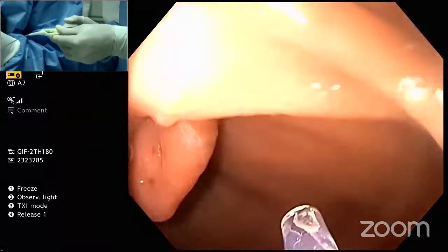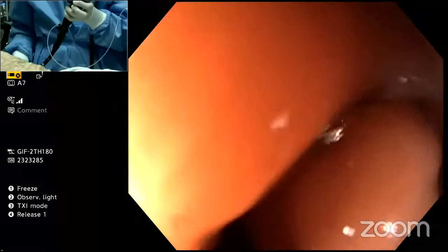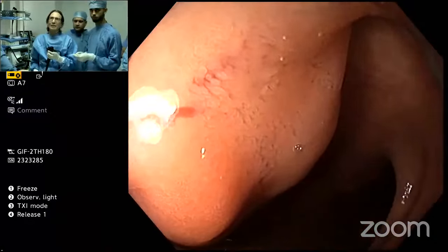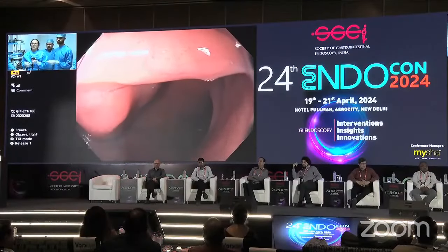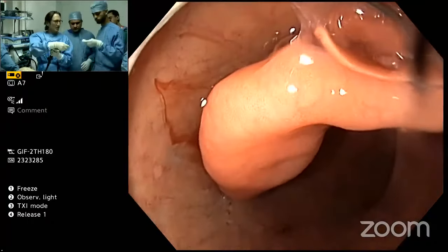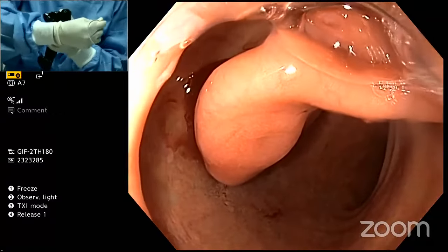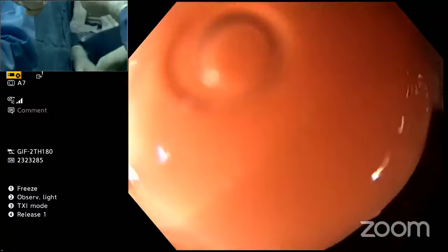What happened here? Where's the suture? All right, let me go inside and see. I don't know what happened. Let me look. There's supposed to be the suture that I'm pulling out. Well, folks, let me just pull this out and see what happened. I don't know. Maybe it somehow mal-deployed, or is there an anchor on there? Yeah, for some reason, it didn't fire. Did you pull it all the way back before? Oh, you just give me another one. There's another one there. It's okay.